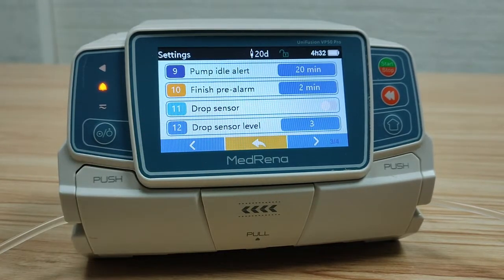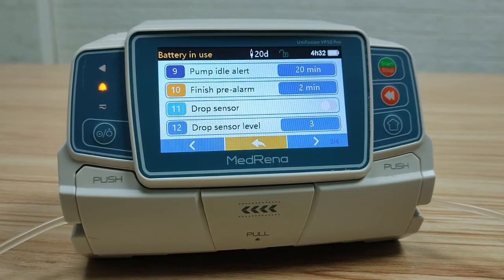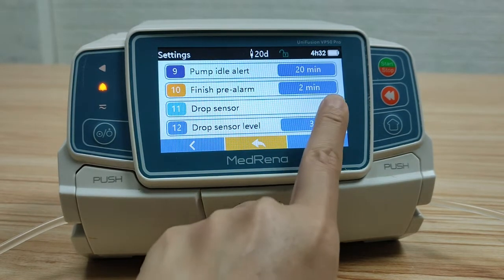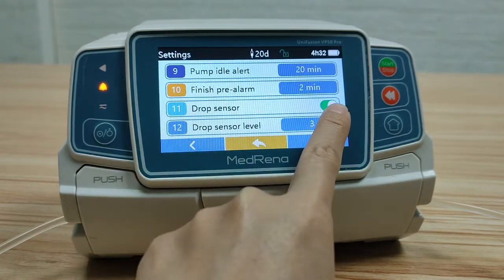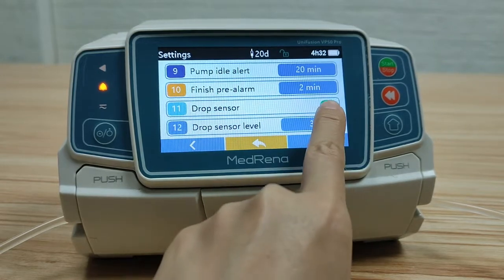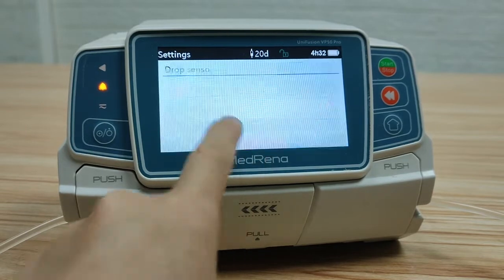Drop sensor is an optional accessory to the pump. It helps to monitor the drip rate and trigger an alarm when the reservoir is empty. When the drop sensor is in use, select drop sensor on. For drop sensor level, there are three levels for choosing.